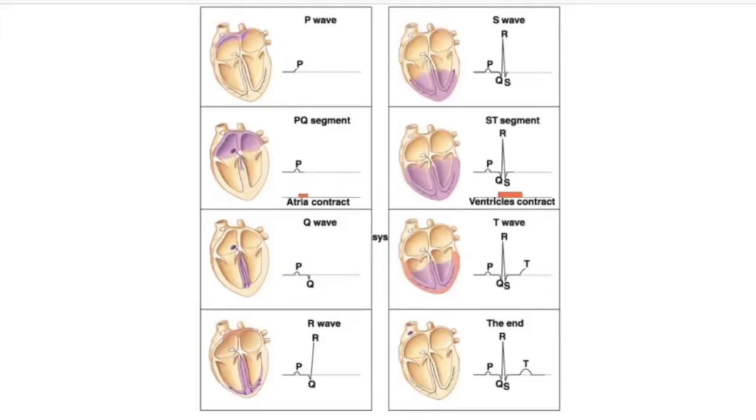For instance, I'll go ahead and draw what a couple of those might look like. Maybe that'll help. Let's insert an arrow. I'm going to center them all on the center of the heart, because we're looking from far enough away. We're asking what is the approximate direction of activation, which is what we represent by this dipole.